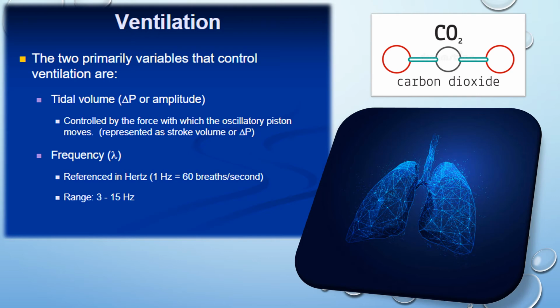As the amplitude increases, the pressure gradient increases and, therefore, the tidal volume delivered to the patient increases. The increase in amplitude depends on the resistance the piston must work with to move forward. If the patient has low lung compliance, the piston must work against a greater pressure, resulting in less change in tidal volume. The same can be said for a patient with high airway resistance.